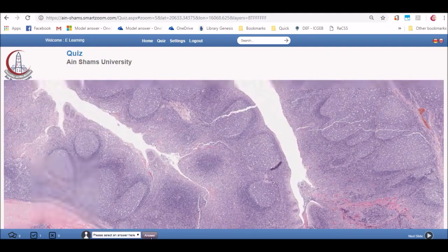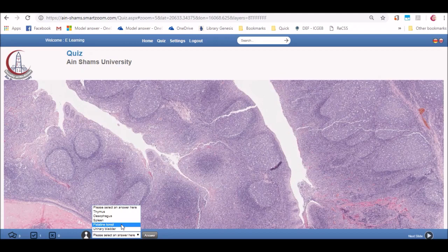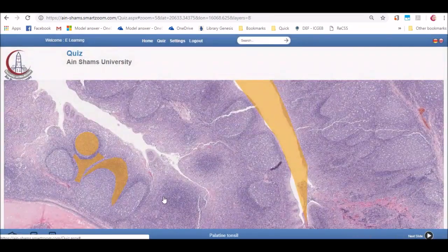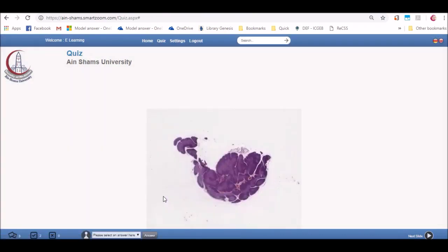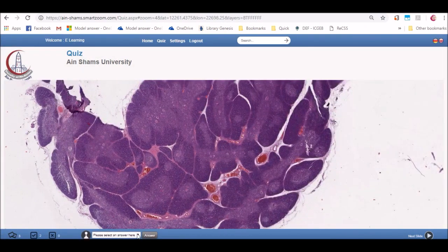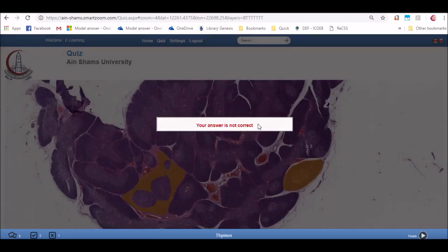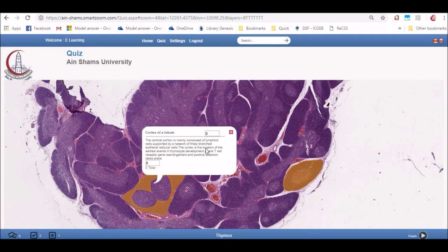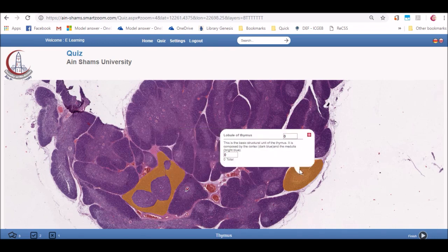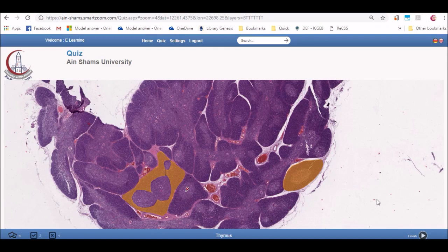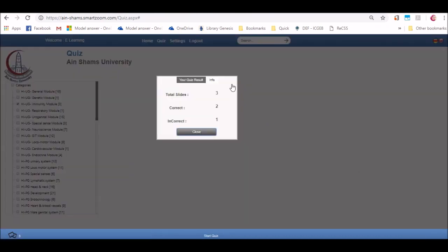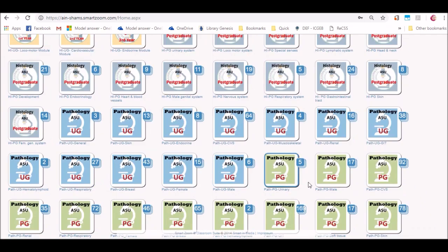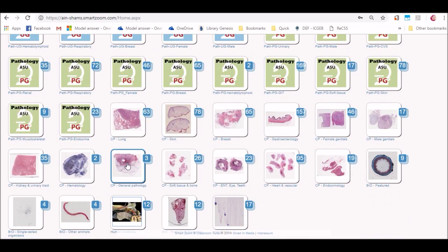When you answer the slide, the slide will appear with all its annotations and information given. Then you should click on next. After finishing the quiz, a message will appear including the total slides you were examined on and the total correct ones and the wrong ones. You can always click on home and return to the given categories.